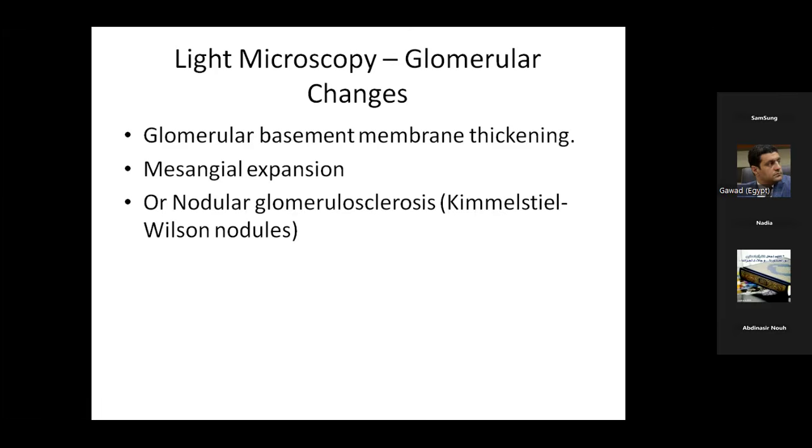Under light microscope, first I would like to say something. That renal biopsy is not done for a classic case of microalbuminuria in diabetes means that the pathology is not seen regularly during our routine work as nephropathologists. No, we see it frequently, maybe because the patient was not known as being diabetic, or was not properly investigated for hemoglobin A1C.